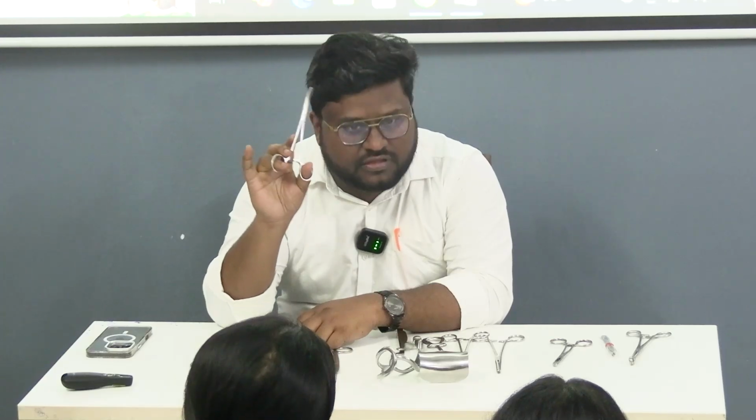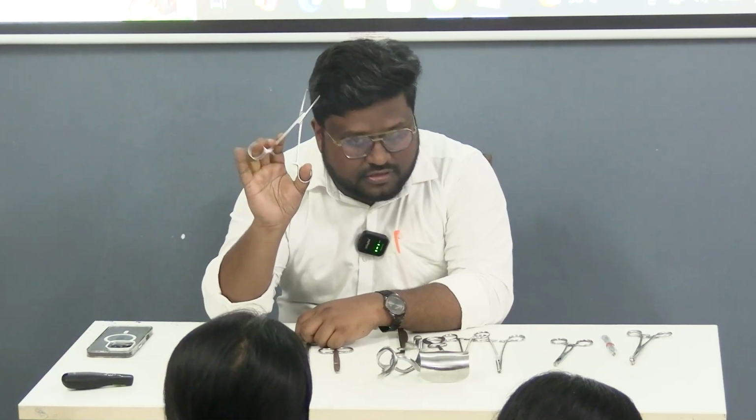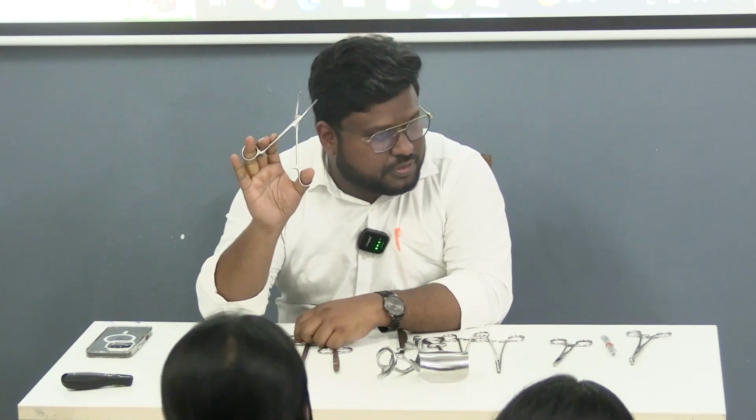Everybody is blank. Spencer Wells hemostatic forceps. Spencer Wells, W-E-L-L, Spencer Wells hemostatic forceps. Hemostat. Bleeding বন্ধ করতে কাজে লাগে, it's called as hemostatic forceps. During the initial part of the video, we saw that I was holding some bleedings with this and cauterizing it. This is used for holding the bleeding points. Hemostatic forceps.